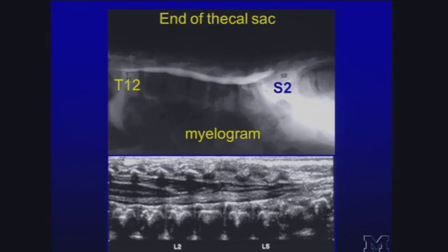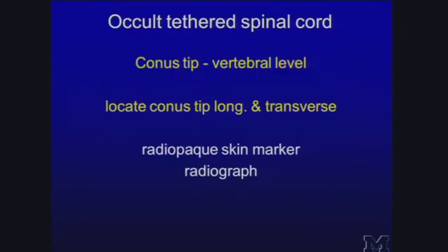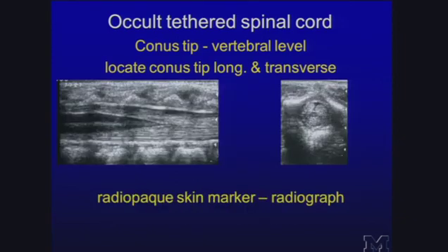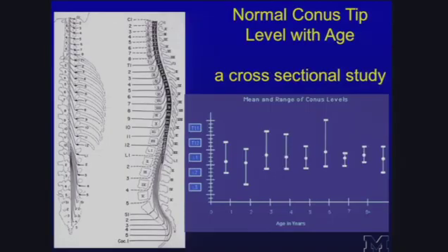So you've heard a couple of ways to do it, and the only thing I can tell you is that if you've assigned a vertebral level, looked at it with all these different ways, and you keep getting the same assignment, like L1 or L2, it's probably right if multiple methods are giving you the same number. If you're getting some variation, well, again, there could be some anatomical variance, as I said, for instance, the number of ribs that the child has. And if you're in a tough spot and it's necessary, you can always put the marker on, but I found that is rarely needed. And if you do, make sure you put it exactly on the conus tip, as noted in both views.